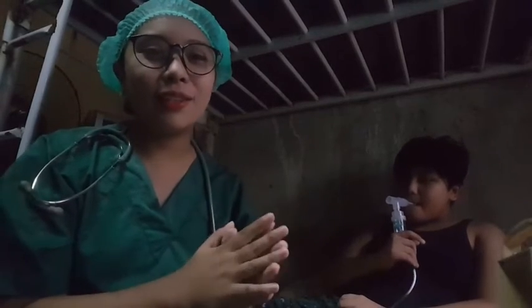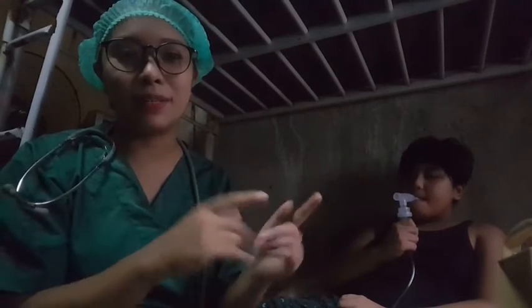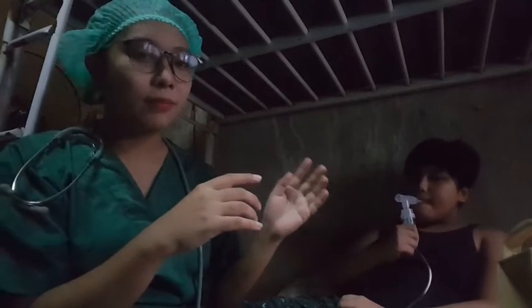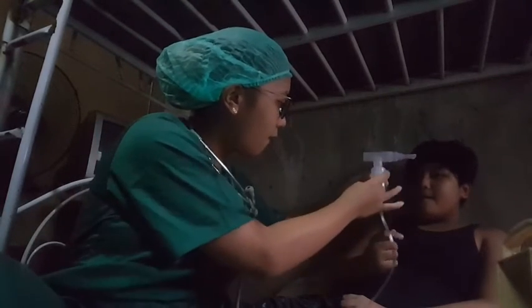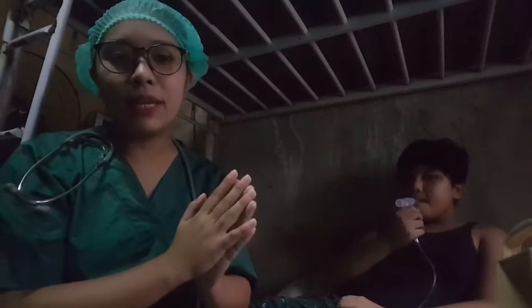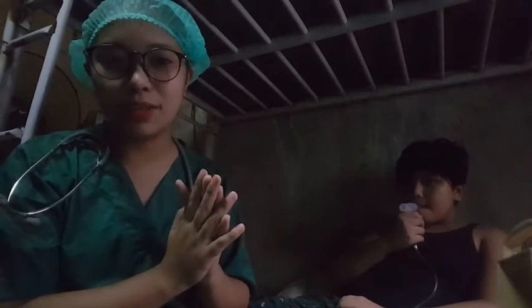Now, continue this inhalation technique until all the medication in the nebulizer cup has been aerosolized, usually about 15 minutes. Once the fine mist decreases in amount, gently flick the sides of the nebulizer cup. So when it's nearly done, we can flick it like that and then put it back in for safety. Now have the patient gargle with tap water after using the nebulizer, and clean the nebulizer according to the manufacturer's directions.